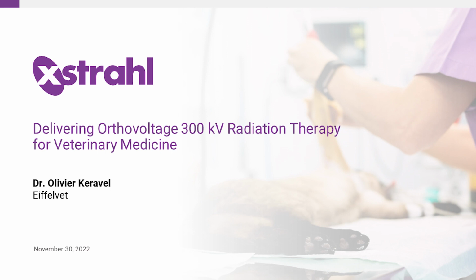How often do you need to refer your patients out to a provider with a linear accelerator? Anytime I consider that I cannot, with my machine, propose an adapted treatment that will control correctly the tumor and limit the side effects. So anytime I have a consult on a brain tumor, anytime I have a consult on a nasal cavity tumor, these are the two main tumors where I will present all the different options, all the different machines, either palliative or curative intent.